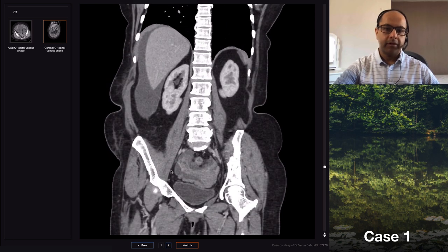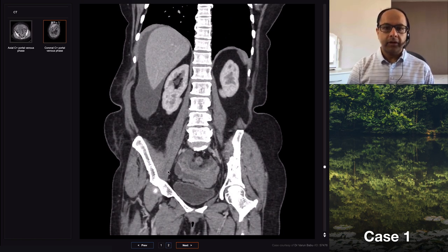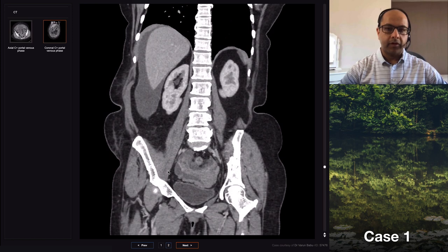These findings are concerning. There aren't any other differentials I can see. I would recommend correlation with tumor markers such as CA-125, doing an MRI for the pelvic lesion further, and an omental cake biopsy ultrasound-guided.